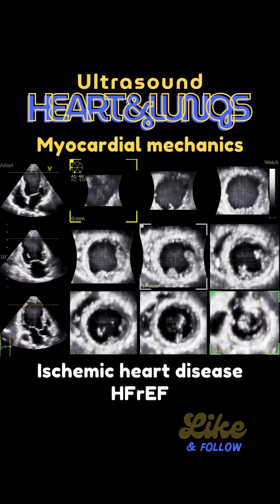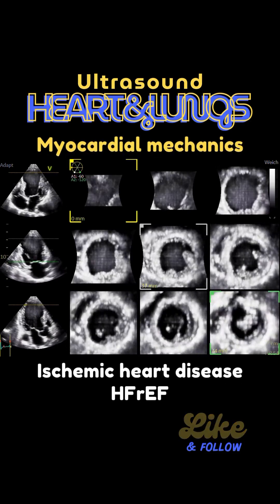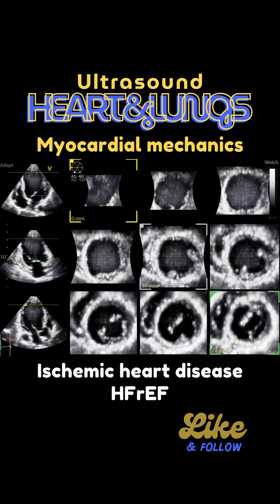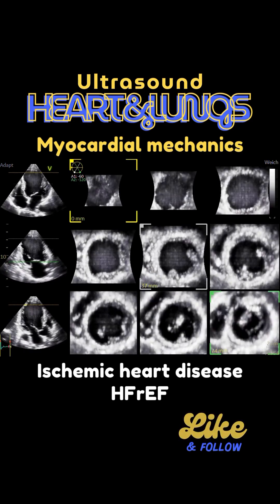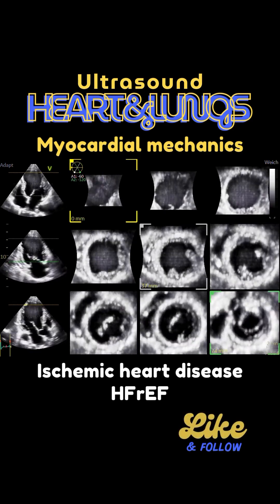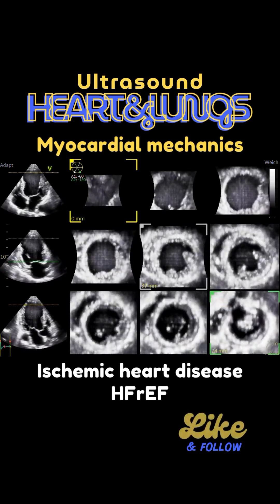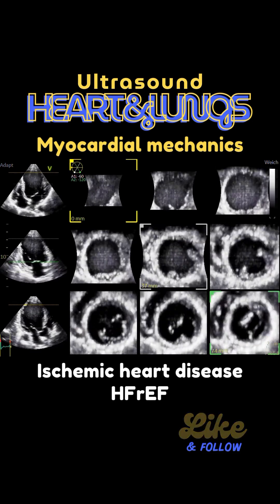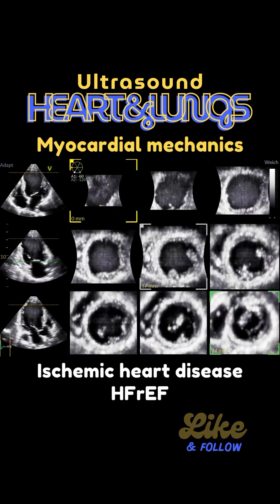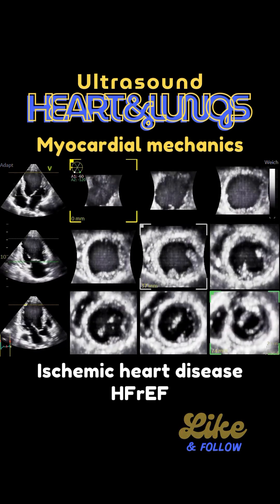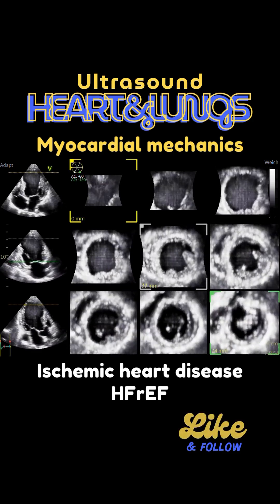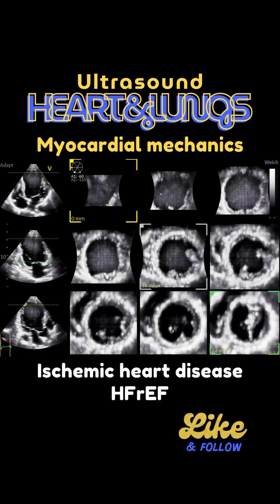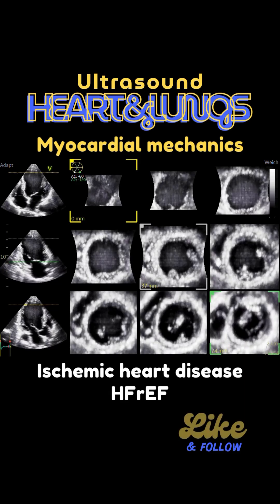In this next example, we see another 3D data set with a patient with a huge left ventricle, and it's evident that there are wall-motion abnormalities in the apical regions. This is a patient with heart failure with reduced ejection fraction, in the range of 20 to 25 percent, and also having the problem of an ischemic heart disease.